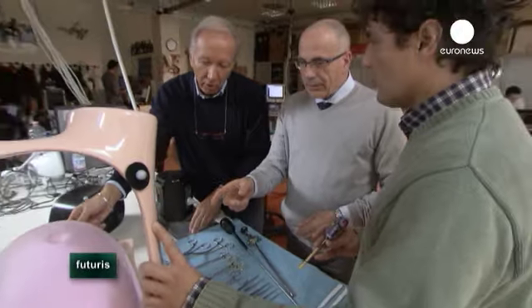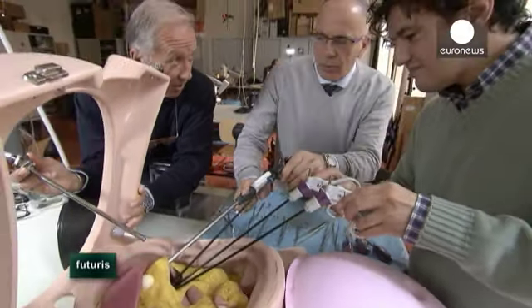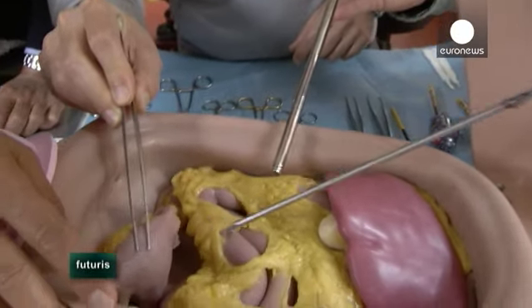Some researchers think surgeons will never disappear from operation theatres, but see robots as a useful tool to increase the accuracy and efficiency of existing techniques. A surgeon, a human being, is not always able to have the same perception, the same precision that surgical equipment and sensors can have. So an autonomous robot could eventually perform some surgical techniques while at the same time acquiring precise data that could complete what the surgeon can feel and see with his own eyes and hands.